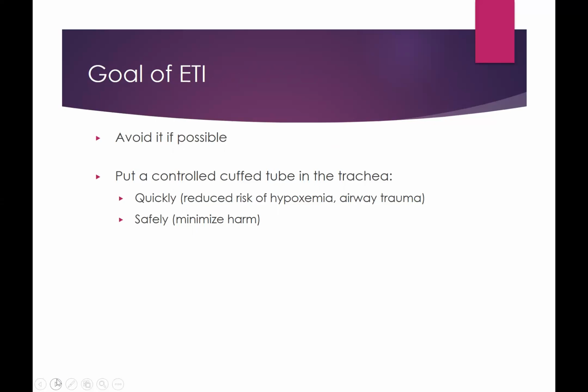If we have to intubate somebody, the goal is to get it done quickly and to get it done safely so that we can really avoid a lot of those risk factors that we talked about.